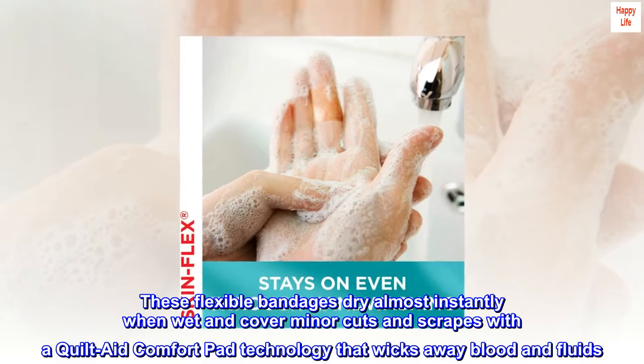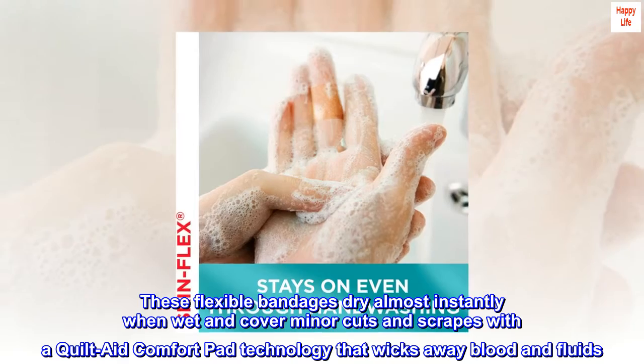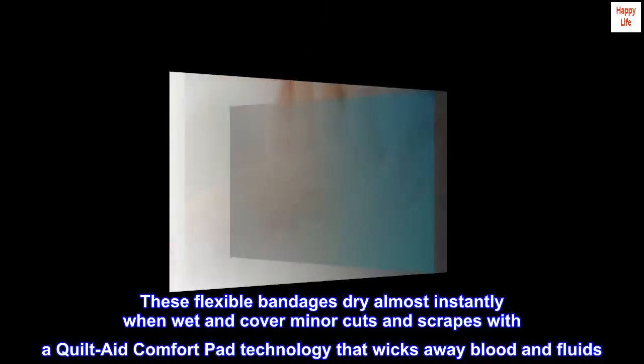These flexible bandages dry almost instantly when wet and cover minor cuts and scrapes with a quilt aid comfort pad technology that wicks away blood and fluids.